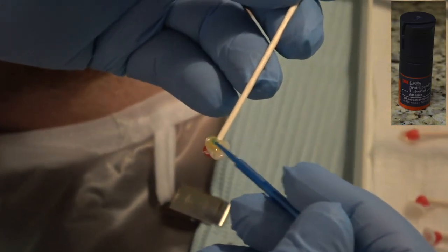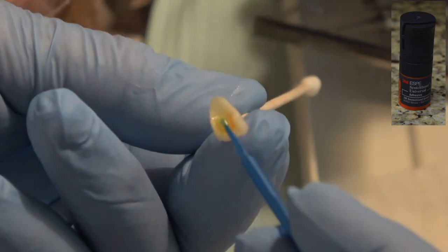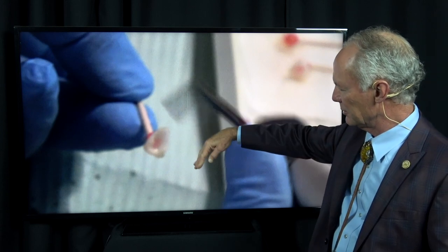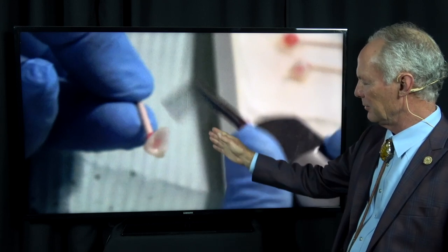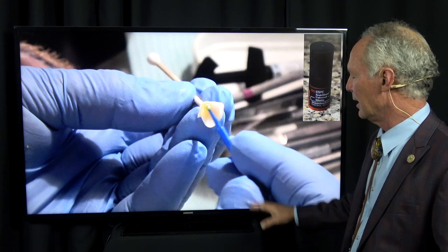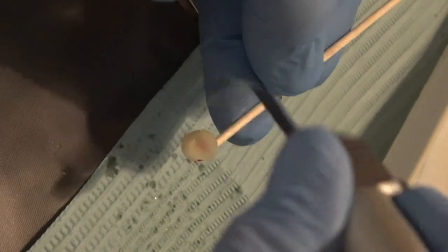Okay, so I've dried the veneers and I've put the primer adhesive into the veneer. Put a lot of it in there and then blow it off. Now, I like to turn the veneer down this way where the incisal part is away, and I'm actually blowing into the incisal part to be sure there's not any pooling of the primer adhesive in the incisal part of the tooth side of the veneer. So you want to blow all that off. This is getting rid of the acetone carrier. Remember, the acetone carries the primer into the dentinal tubules. But it's very important that you get rid of the acetone because it can affect the bond strength. So blow it off until nothing wiggles. Plenty of primer adhesive on there after you've blown it off.